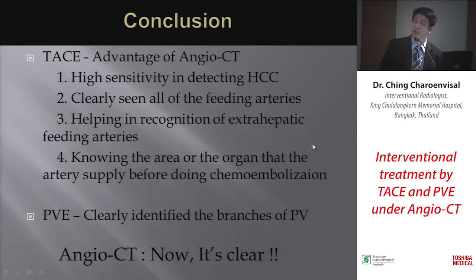So, conclusion. For TACE, the advantage of Angio CT is, first, its high sensitivity in detecting HCC, clearly seeing all of the feeding arteries, helping in recognition of extrahepatic feeding, and knowing the area or the organ that the artery supplies before doing the chemoembolization.